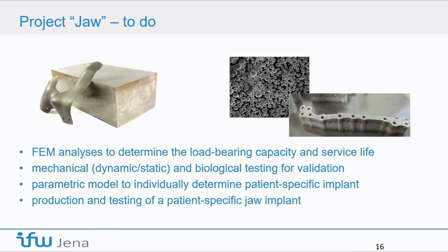So typically, traditional machining of implants is done, and on the left side you can see a block and then the resulting implant, and over 90% of the block goes to chips. And titanium is not easy to machine, so it's time consuming. To get a better solution, you can use powder and build the part. But you need some design rules, what can be done with the material.